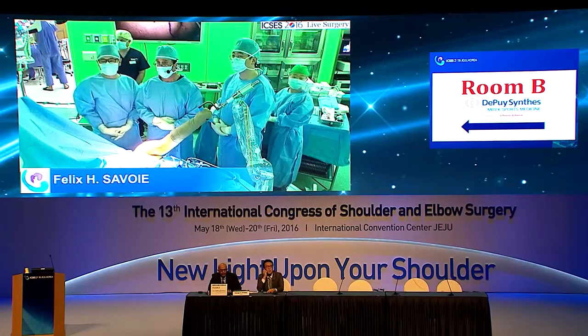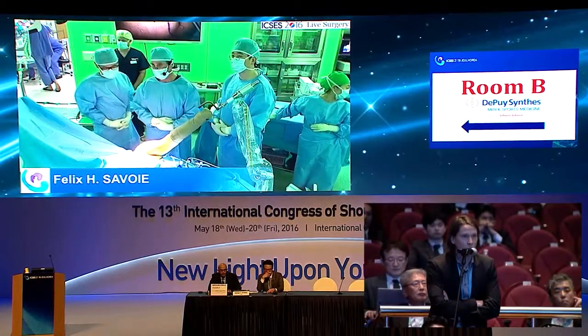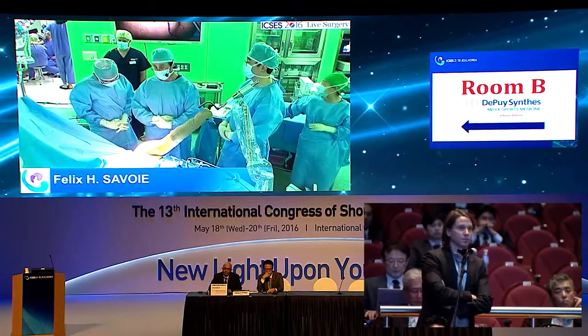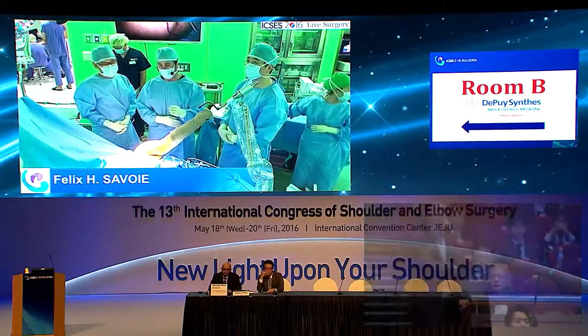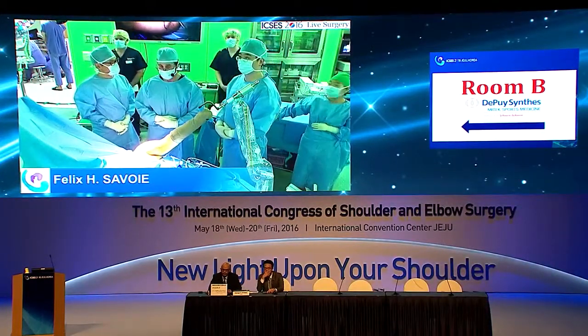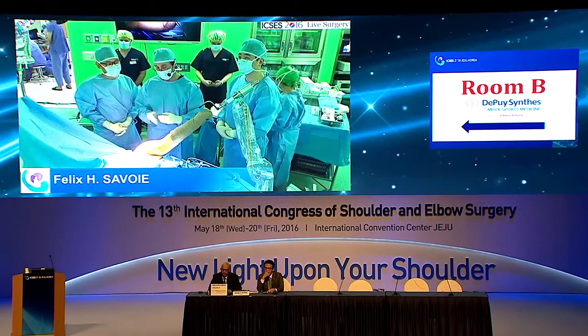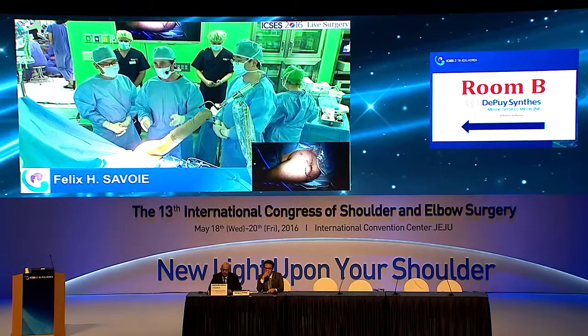If there is a lateral stump left on the greater tuberosity, how much would you leave for reattachment? How much would you resect? So how many millimeters? If there's a lateral stump on the tuberosity, I will leave it, and I may lay it down to the cuff, or I'll take it out entirely. I think that's not good tissue, and it's not going to help. But I also move my lateral part of the repair medially to account for that loss of tendon.